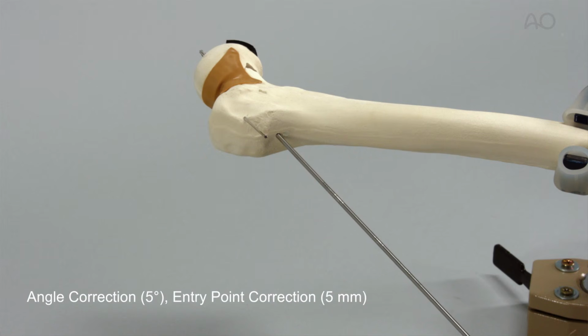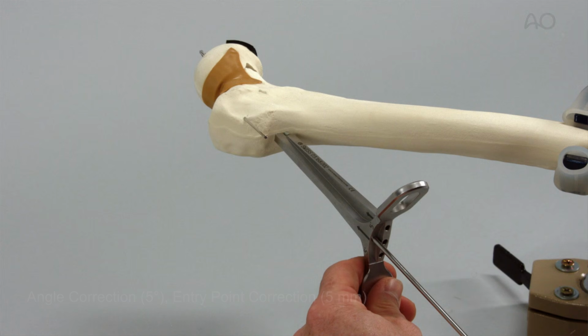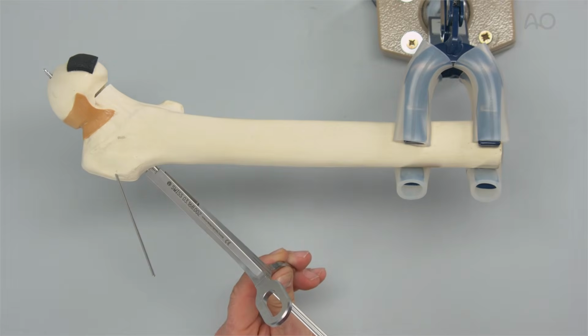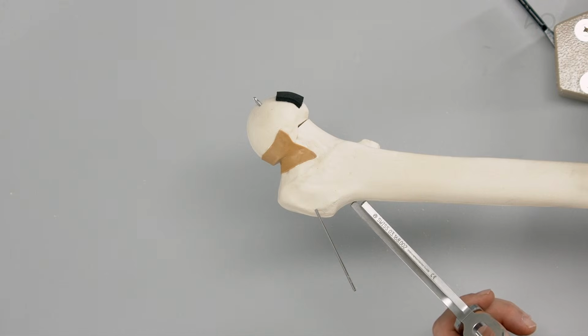The correction guide is passed over the initial wire and rotated to achieve a more distal entry point. A new guide wire is passed through the 5-degree angle hole of the guide, and the guide wire is inserted to achieve a more posterior position. The first incorrectly positioned wire is removed.